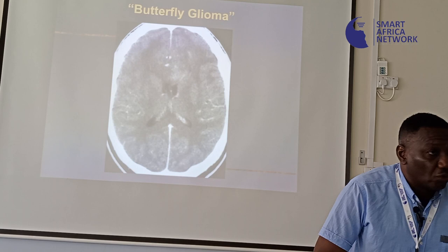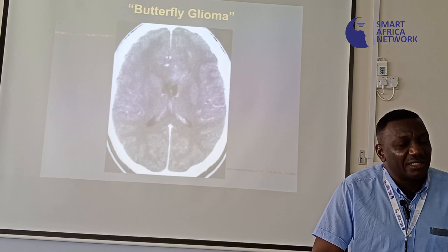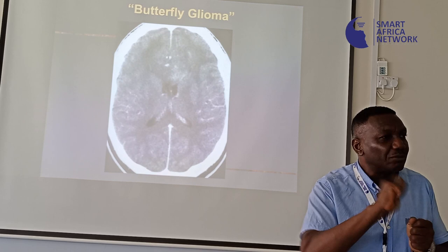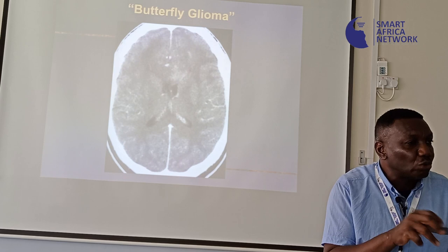You can have, sometimes, this is an imaging technique. This, MRI or CT, is a CT image. Okay. Now, one of the drawbacks usually of MRI is that it has the tendency not to be able to demonstrate bone because there are no signals. All the hydrogen nuclei within the cells are tightly packed. So you cannot pick any signal from bone in MRI. So bone usually appears dark on MRI. Blood is also dark. Vessels are dark. So it's very difficult to see bone.